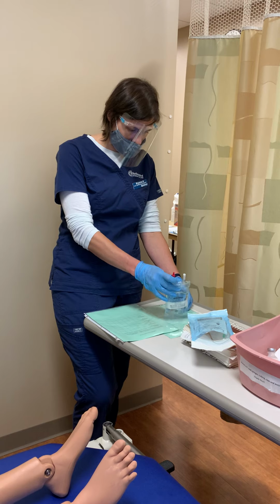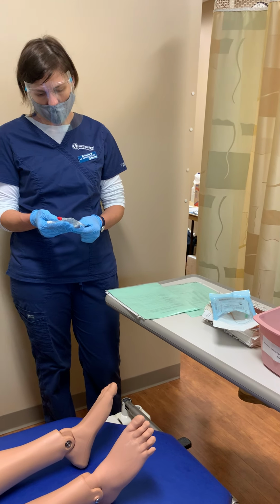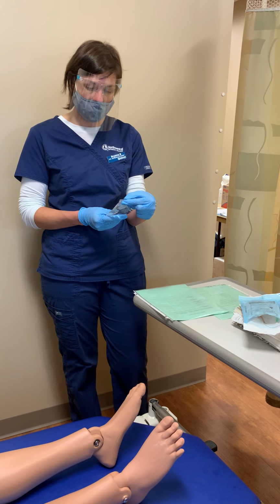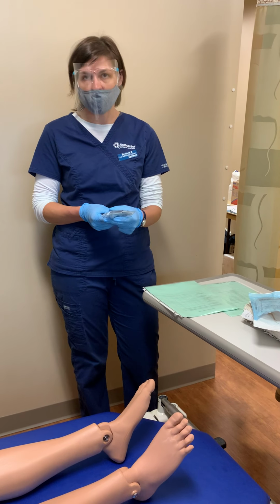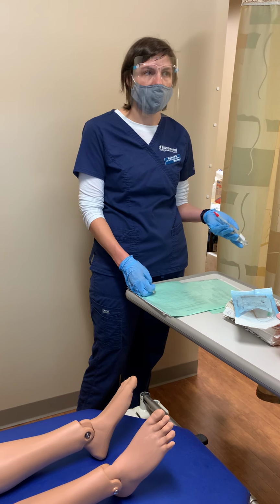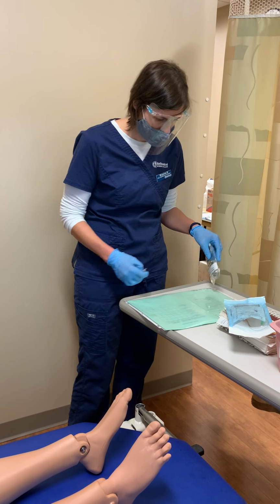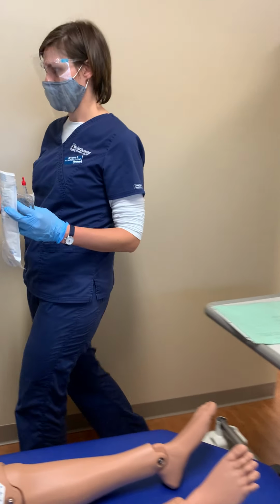Last thing I'm going to do with my checks is I've looked in my bag. I don't see anything floating, any weird inconsistencies, anything of that sort. And my expiration date is good. It doesn't expire until 2035. So this is a usable bag of potassium chloride. So I've done my 5 checks 3 times, and now I can go ahead and get her secondary set up.